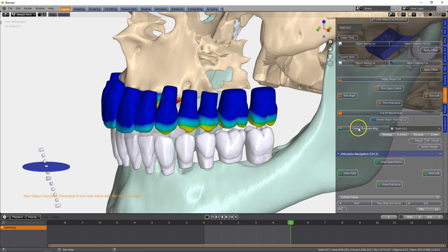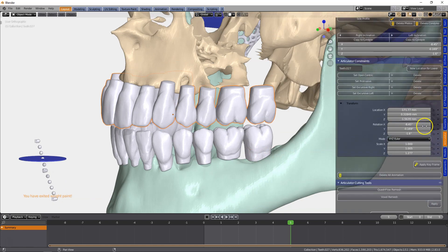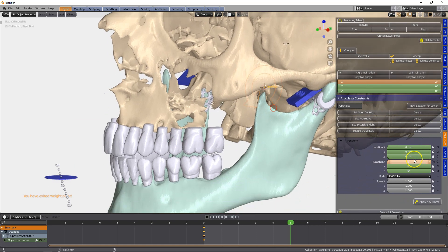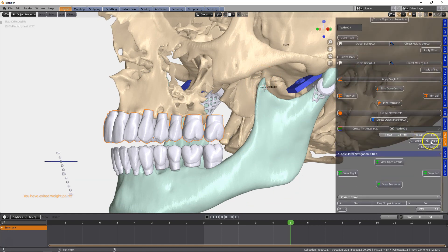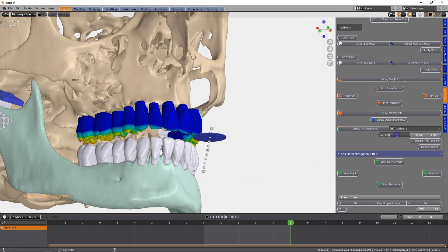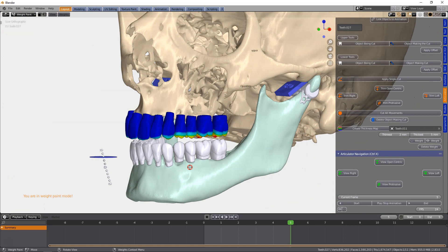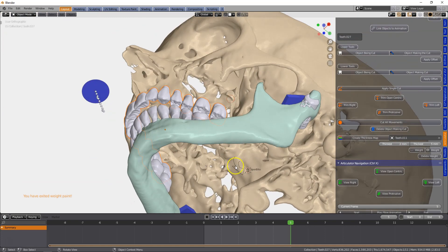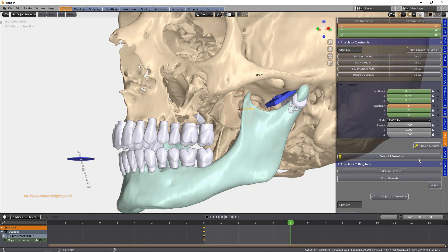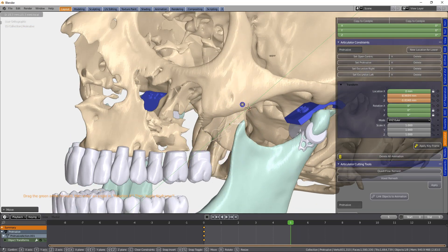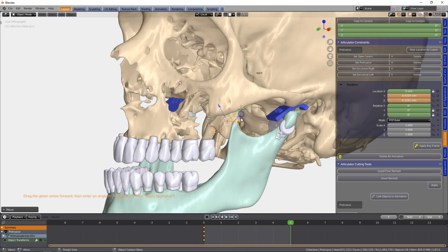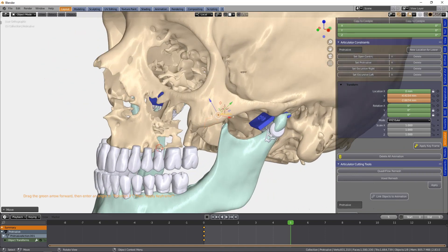If we hypothetically want to open the jaw further, we exit this object and set the degrees to something else — say three degrees, which is six millimeters open on the articulator. We can then view the distance one more time, and that seems to be two millimeters in the posterior section. Next, applying the keyframe, you'll see these orange marks which means the keyframe has been set from zero to number five, and we're going to set the protrusive. Note how the lower jaw moves down in the exact angle we set earlier at 33 degrees.